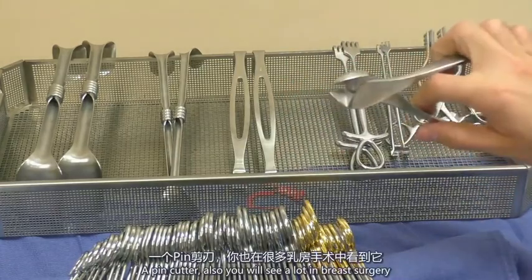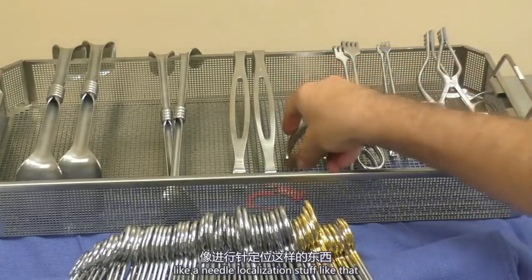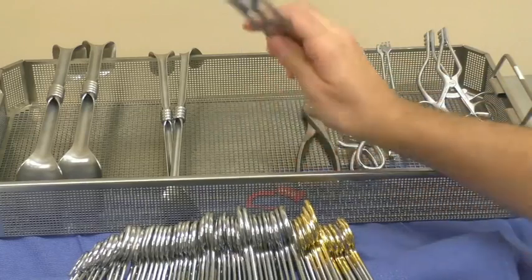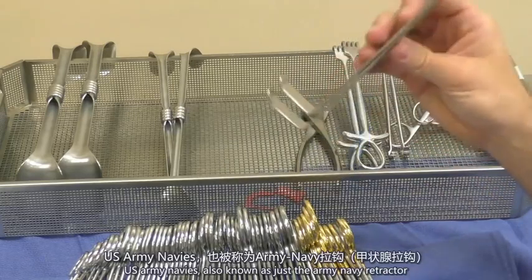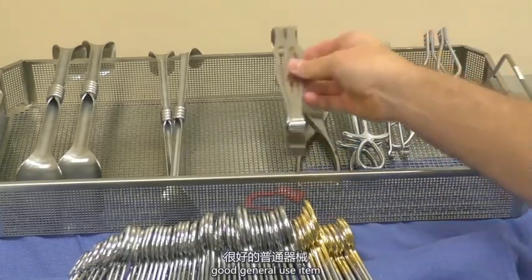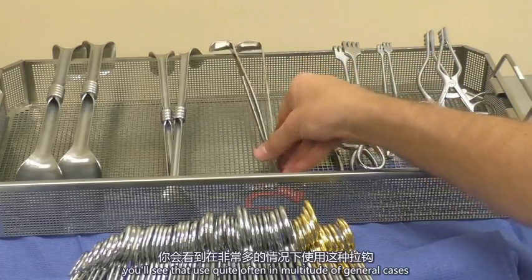A pin cutter. Also, you will see a lot in breast surgery, like a needle localization, stuff like that. U.S. Army Navies, also known as just the Army Navy retractor. Good general use item. You'll see that used quite often in a multitude of general cases.